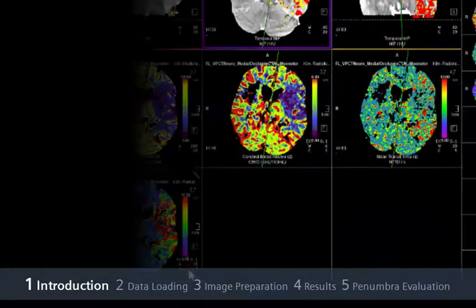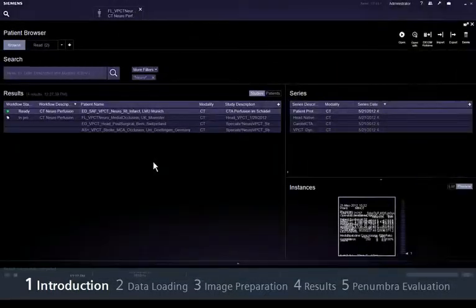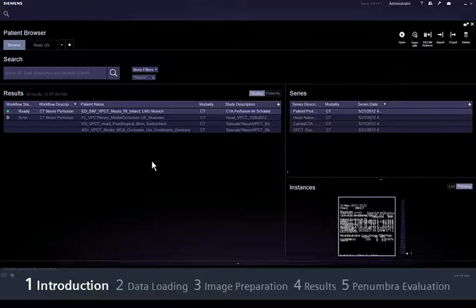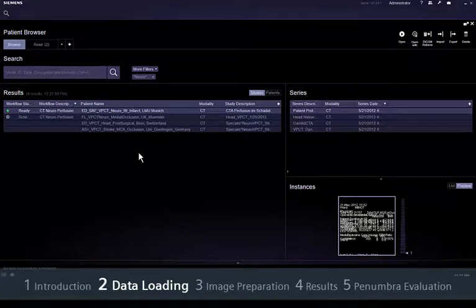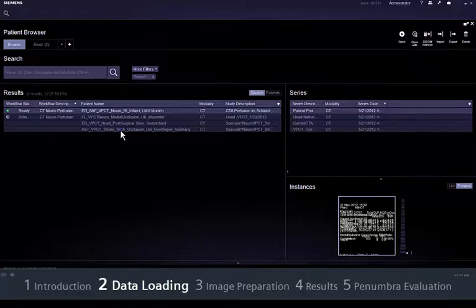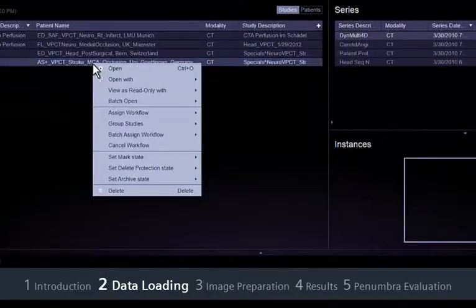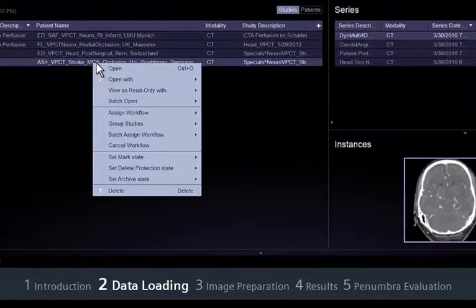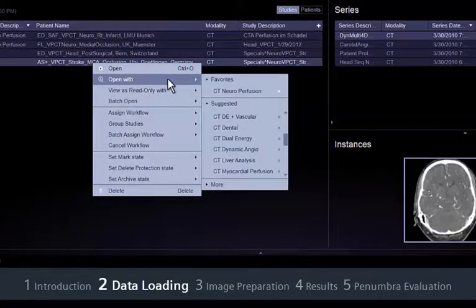This movie will show you how to evaluate neuroperfusion datasets using Syngovia. First, make sure that the study is correctly assigned to the CT neuroperfusion workflow. Otherwise, click with the right mouse button and select Open with CT neuroperfusion.